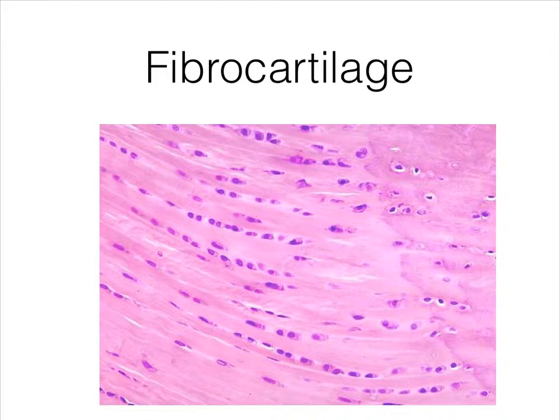The chondrocytes in lacunae, let's see here, have sort of rounder, kind of egg-shaped nuclei in their space, but they are held into these sort of linear bundles, right, where the cells tend to cluster in lines in between the collagen fibers.